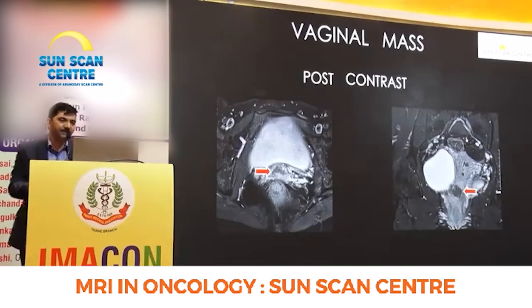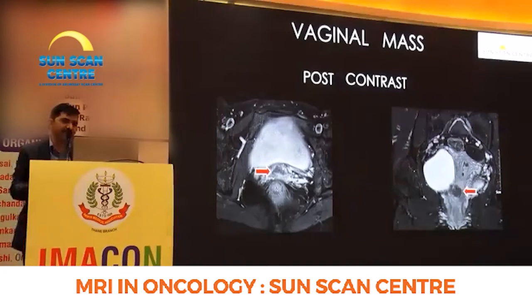This was a female patient where the gynecologist suspected that there is a lesion in the vagina, but a confirmation was required. So this contrast MRI was done. And the arrow points to a lesion which you can see is actually dark on the contrast. So what does that imply? Well, this is a lesion which has enhanced very strongly, very early, and the contrast has washed out from the lesion also very fast. So therefore, although the uterus and cervix are bright with post-contrast, the lesion is still dark.